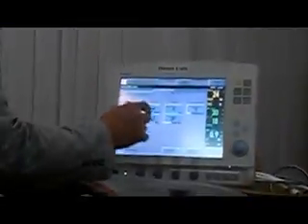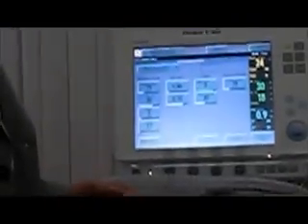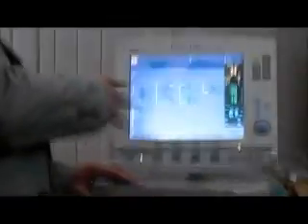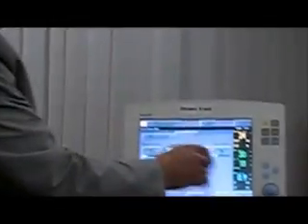Just give us the rate, just give us the settings, we'll put them for now and then you can adjust them. Rate 40. FiO2 is not working, assume it's 60. Yes, 60. Okay, transpiration is 65. Okay, I-time. The flow is 6.